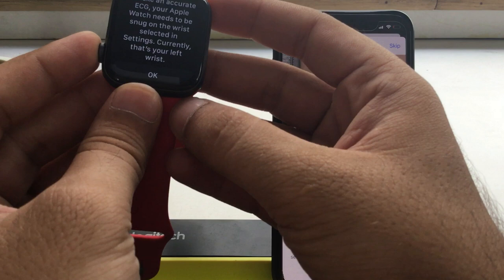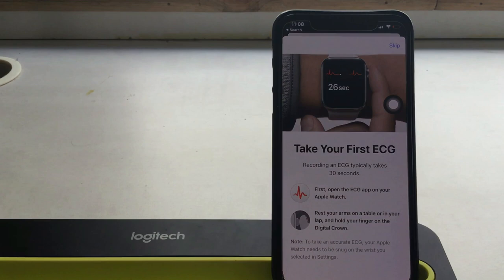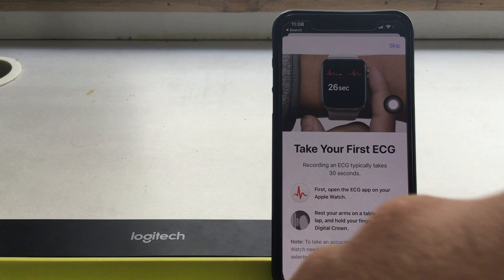Once you complete the test, the result will save on your iPhone health app. From there, you can check all saved ECG tests, export PDF, or delete old recordings.